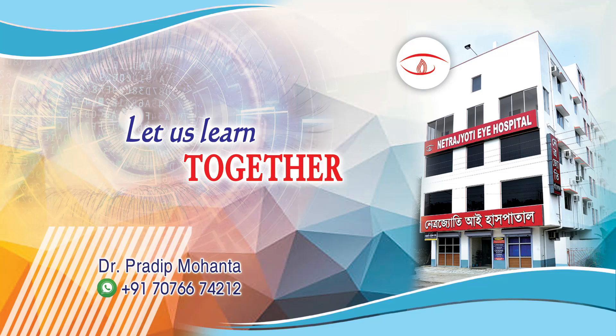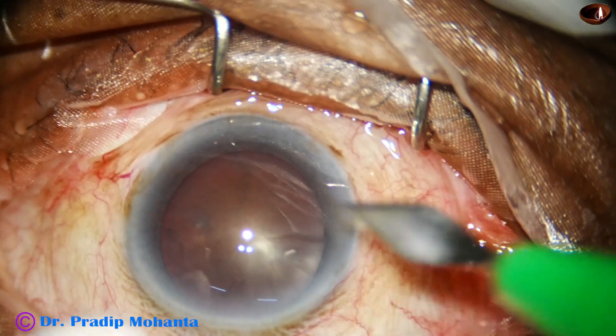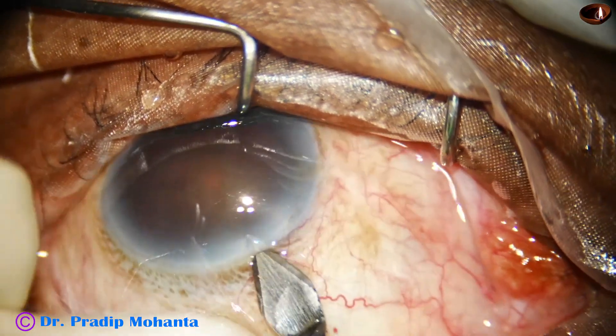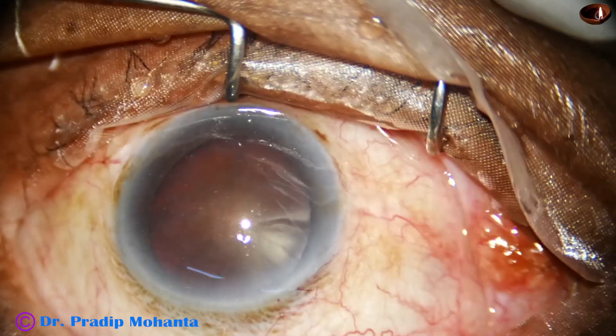Friends, welcome to my workplace at Ranaghat, West Bengal, India. Let us observe management of this very hard cataract. This is a cataract with grade 5 nuclear sclerosis. Fortunately, the pupil has dilated well.